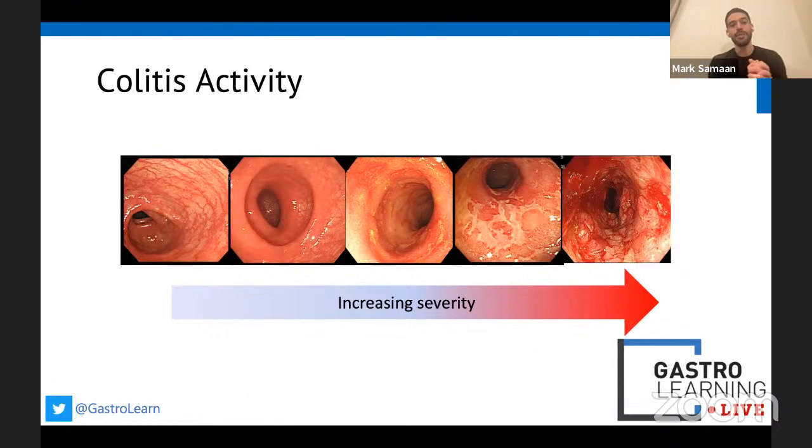So using a score is really important, and that's where endoscopists need to upskill ourselves or maintain our skills to make sure we know the scores, we know how they're used, and we're using them frequently enough that when we need to go to them, they're there.